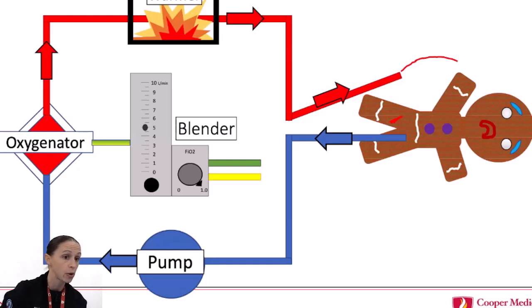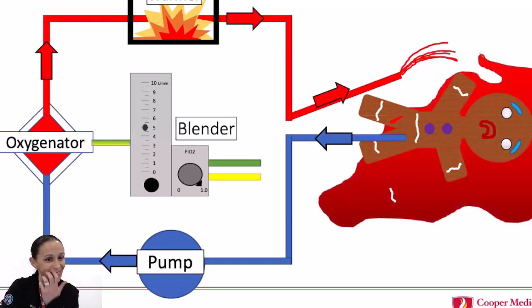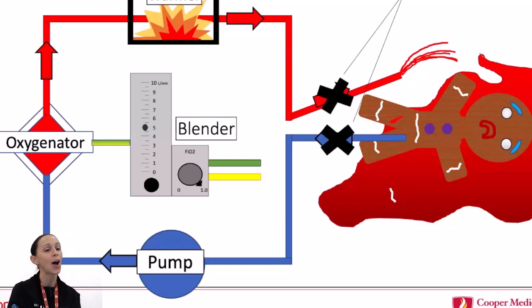Also think about the groin in this scenario, that groin is also going to have bleeding. So someone else can be holding pressure there. So assuming you do have clamps, I love the Dr. Knowles. You draw all this stuff out, right? So we're clamped off. So now we're going to come off. We're going to turn the pump off, and we're going to come off ECMO.